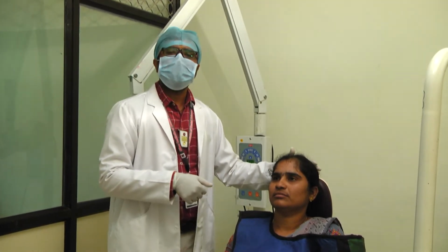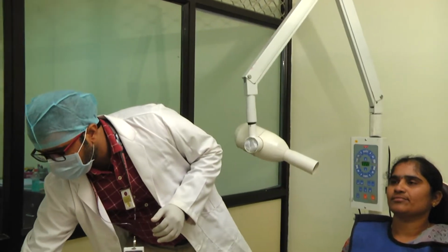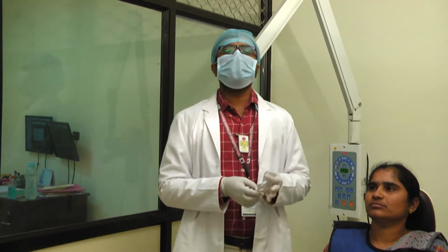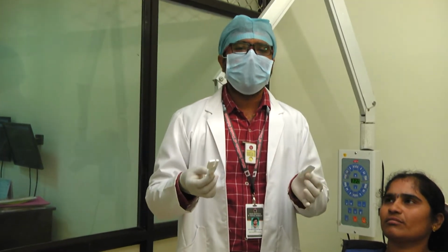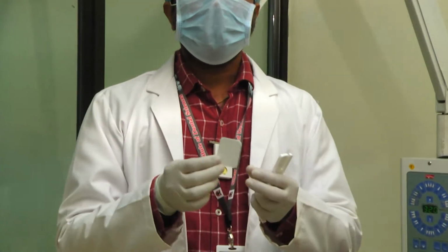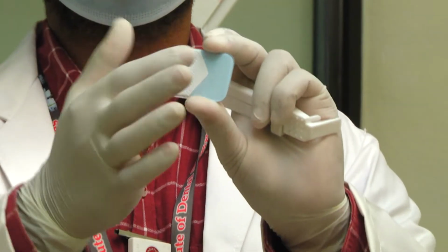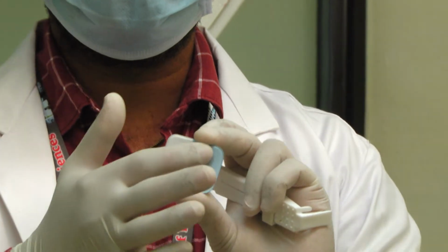The next fundamental step is the placement of the film. This is an intraoral periapical radiograph film, and this is the film holding device called a snap-a-ray, used for the bisecting angle technique. Here one more rule to be followed: when you are keeping the intraoral film in the oral cavity, it has a non-color coded side, that is the white surface, and a color coded side. This color doesn't have any significance; it is a manufacturer's deciding factor.